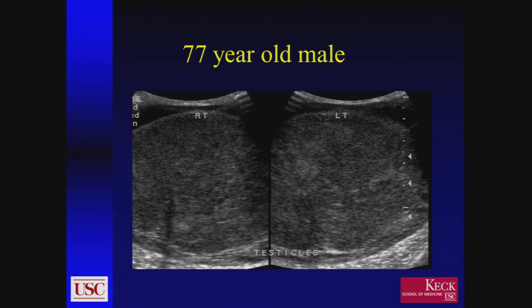Typically, you'll see that in the area of the renal veins. So typically, the metastases will skip the pelvis and then go up the lymphatic chain and deposit themselves in the area of the renal hilus and of the main renal vessels in the retroperitoneum.